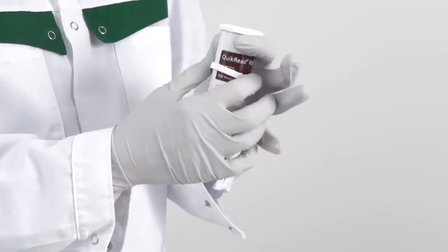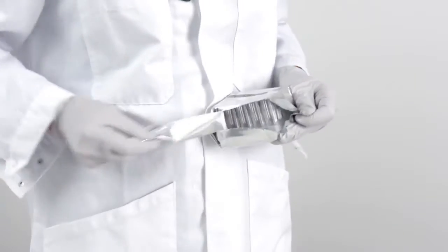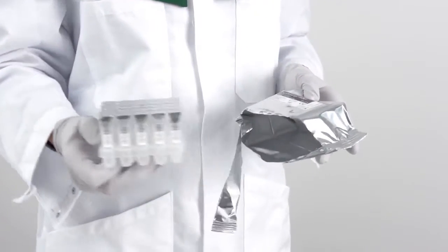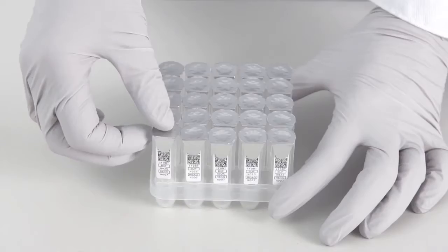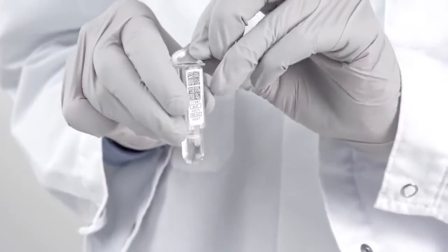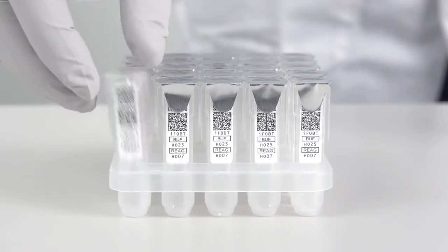Remove the safety ring from the reagent cap tube. Open the foil pouch on the cuvette rack, either by tearing or with scissors. Take the rack out. Take one cuvette, holding it from the sides, and tear the foil cover off. Put the cuvette back into the cuvette rack.